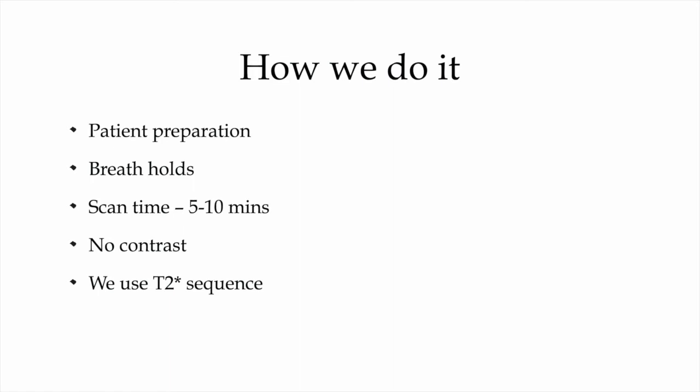The scan time is around 5 to 10 minutes. So it is a very short investigation. There is no contrast involved. And we use the T2 star technique to assess the iron overload.